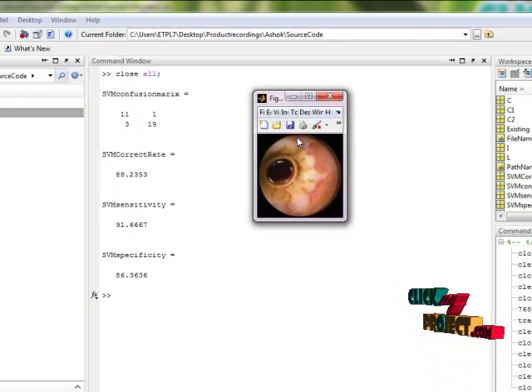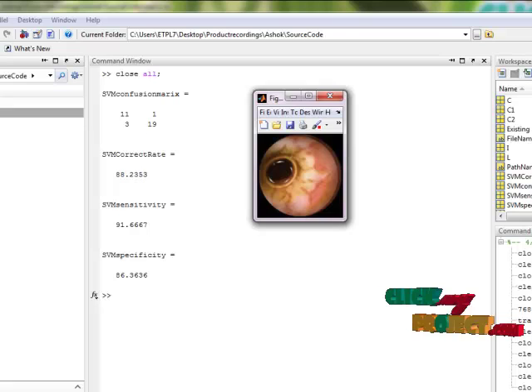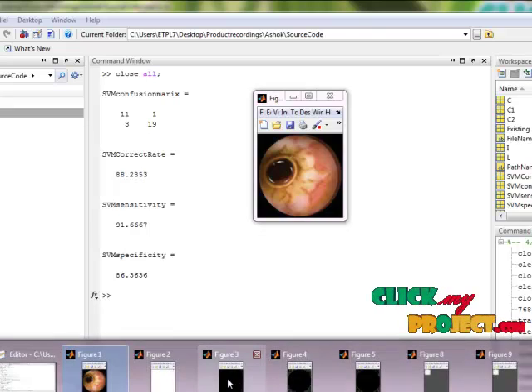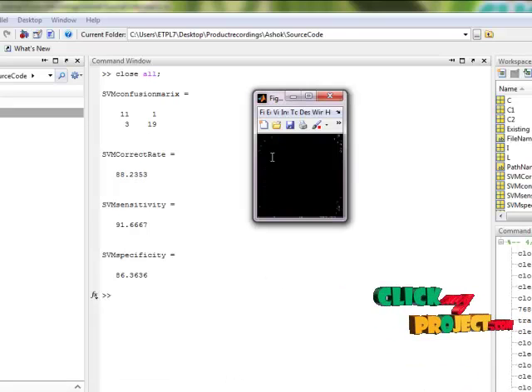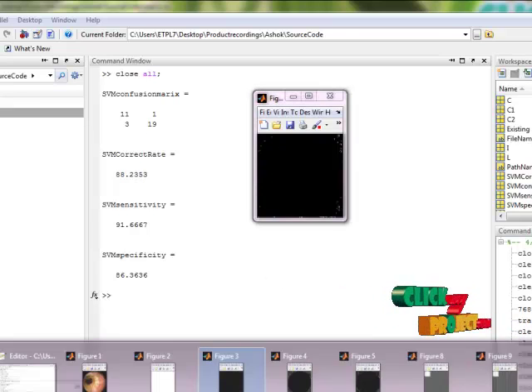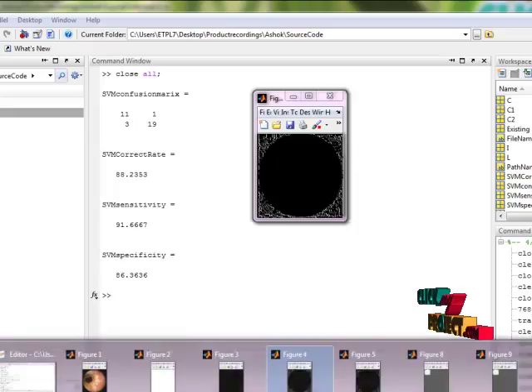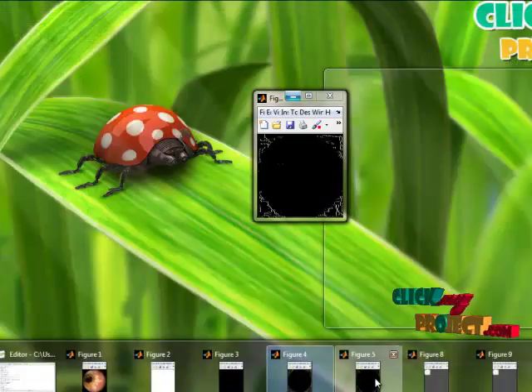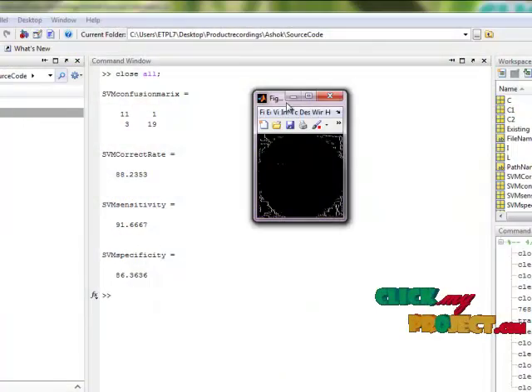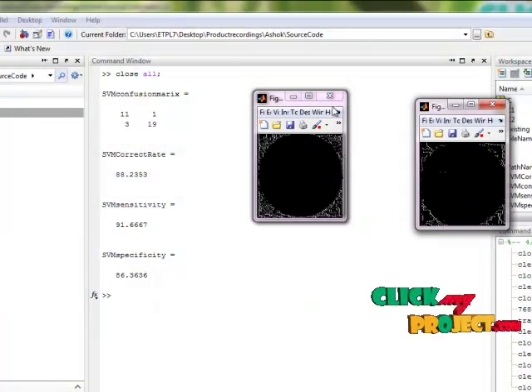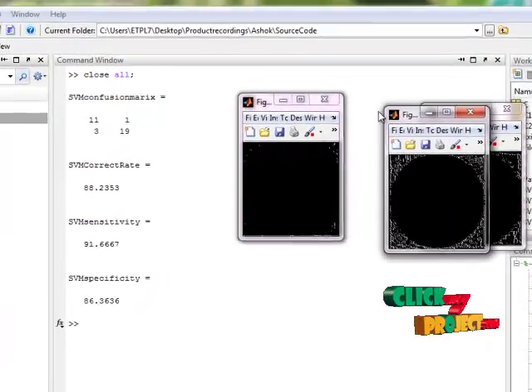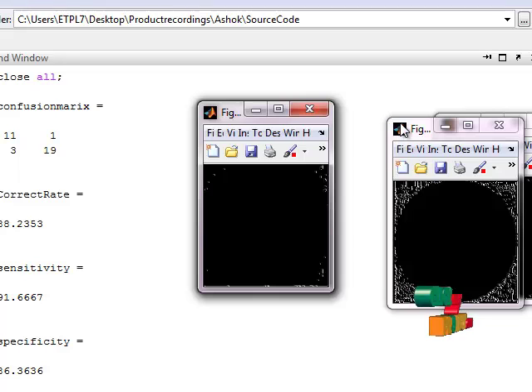This is our original image, and these are the HSV and RGB color conversion images.